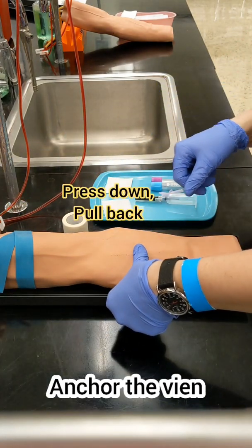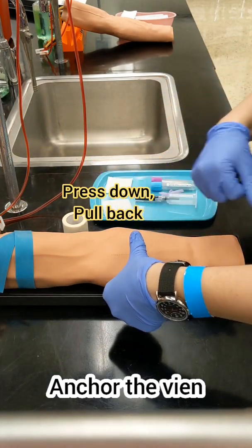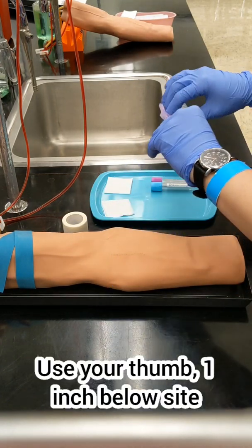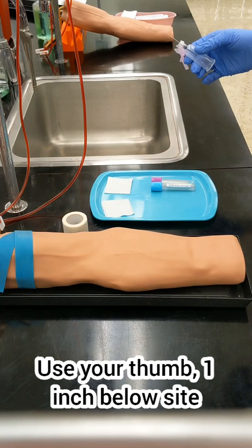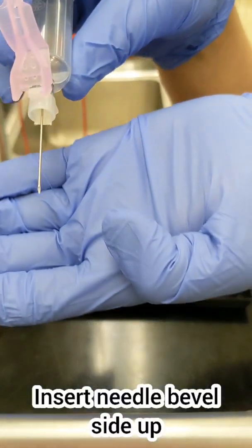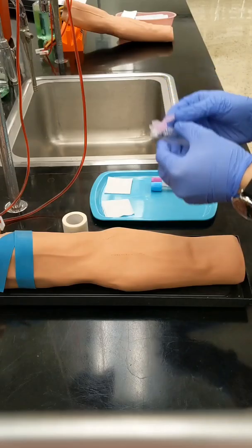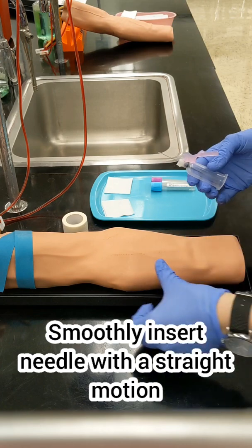Retie your tourniquet and place your thumb one inch below your site to anchor the vein. Gently push down and then pull towards the patient's hand. Now you can uncap your needle — look at the bevel and make sure that bevel is facing upwards, because that will give you the sharpest point to insert into that vein.